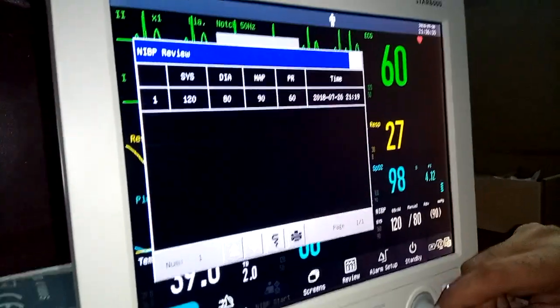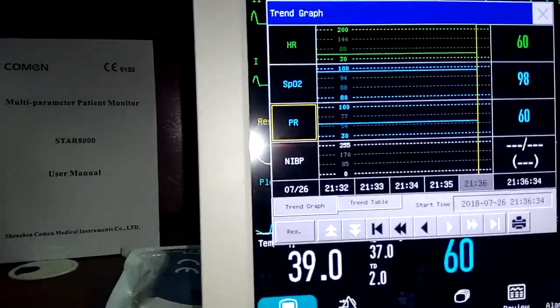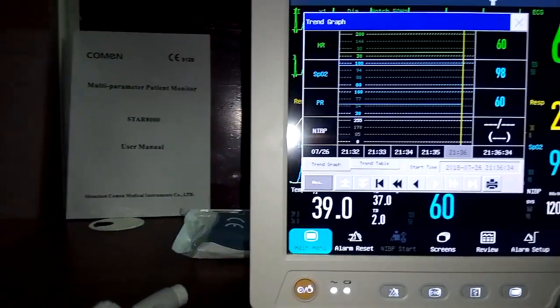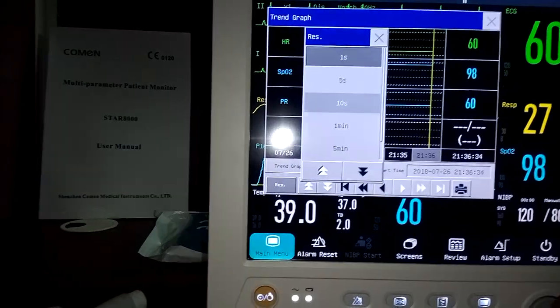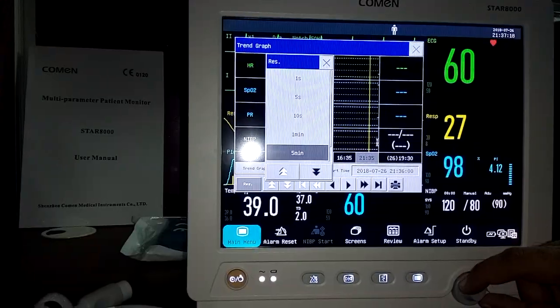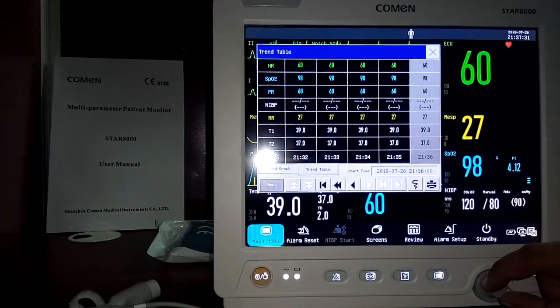In the trend review, you can see heart rate, SpO2, and NIBP trends. You can set the resolution — for example, 5 seconds, 10 seconds, or 1 minute — and the corresponding time window adjusts accordingly (e.g., 5-minute or 10-minute windows). A full trend table showing all parameters is also available.